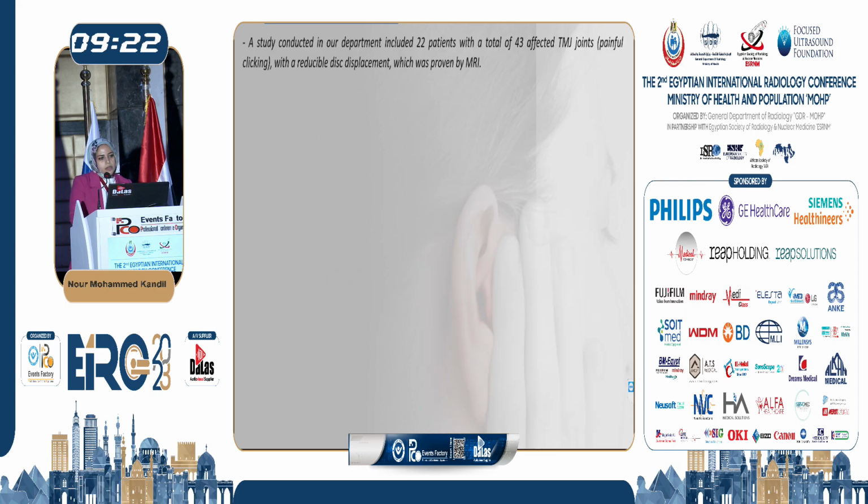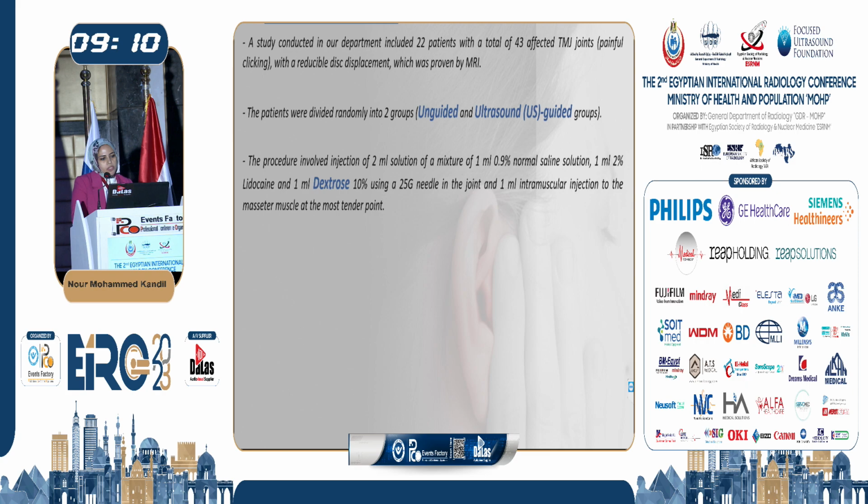A study conducted in our department included 22 patients with a total of 43 affected joints with a reducible disc displacement proven by MRI. The patients were divided into unguided and ultrasound-guided groups. The procedure involved injection of 2 ml solution of a mixture of saline, lidocaine, and dextrose using a 25G needle in the joint and 1 ml intramuscular injection to the masseter muscle at the most tender point.